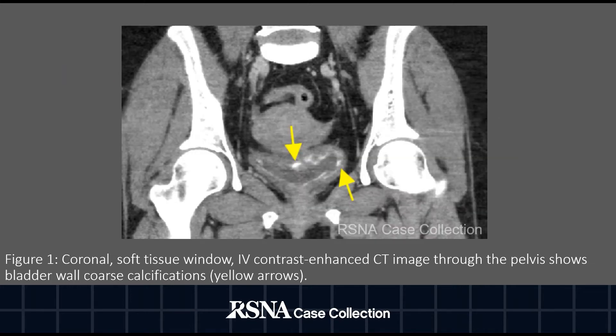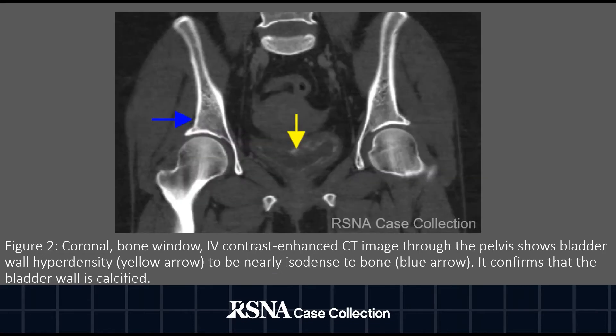Figure 1. Coronal soft tissue window IV contrast enhanced CT image through the pelvis showed bladder wall coarse calcifications. Figure 2. Coronal bone window IV contrast enhanced CT image through the pelvis showed bladder wall hyperdensity to be nearly isodense to bone, confirming that the bladder wall is calcified.